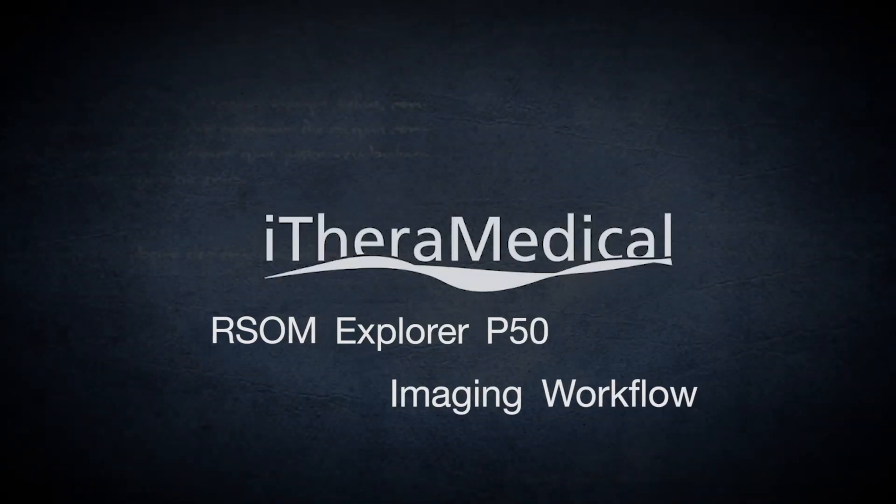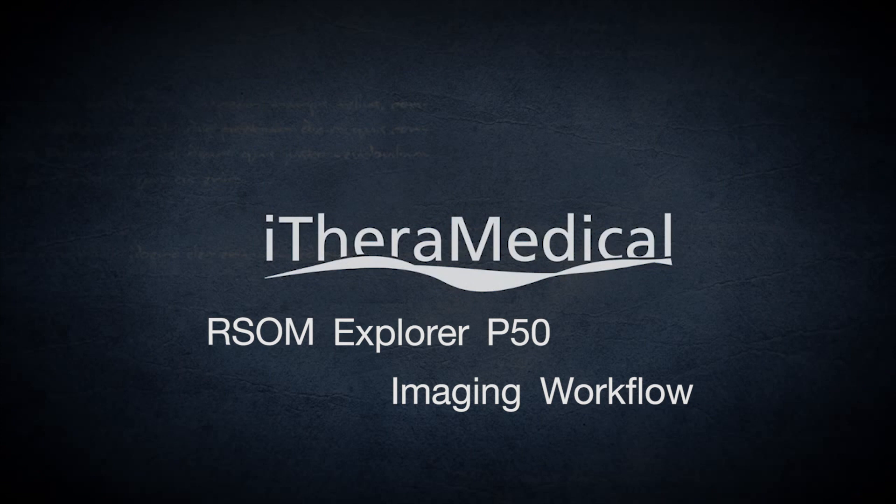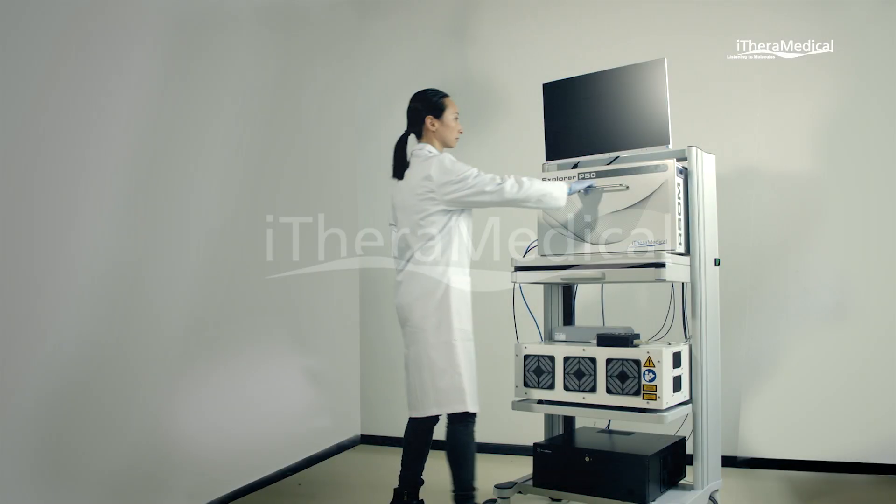The following video illustrates the workflow using an RSOM Explorer P50 imaging system from Ithera Medical.